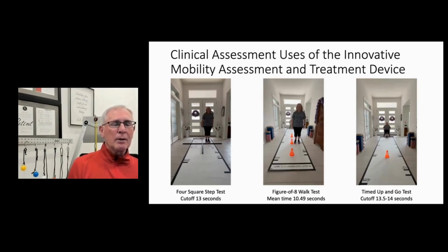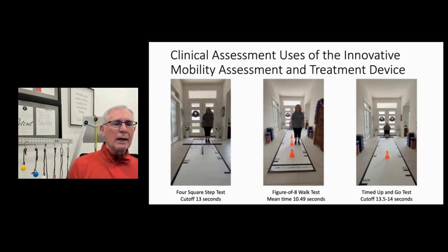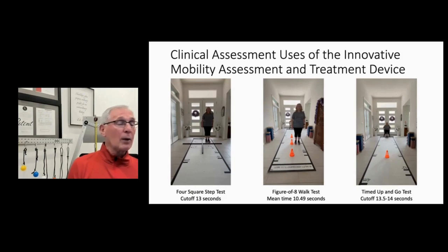In the center, we have the same female do the walk test, and you can see as she goes through very smoothly, very fluidly, she did not stop. She completed the test, and again, probably hits right around what the mean completion time is.